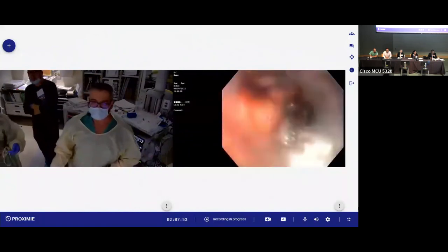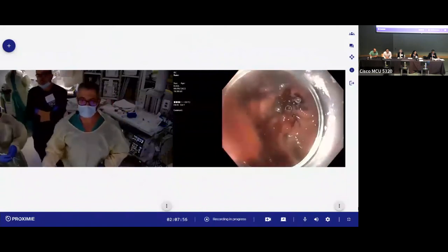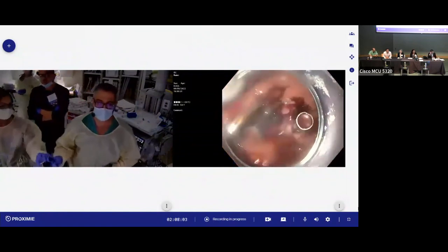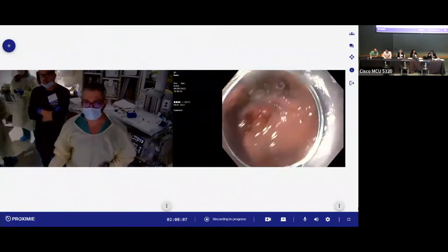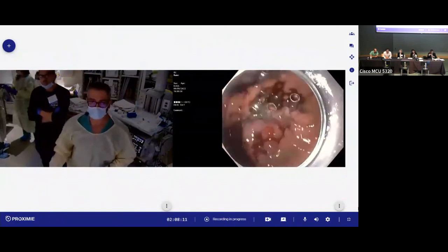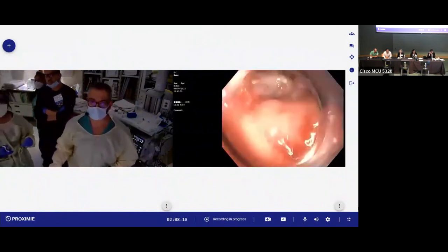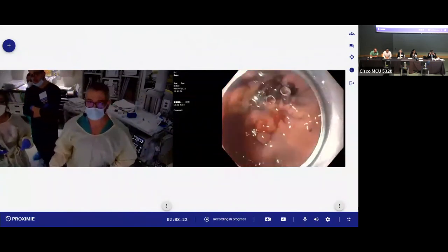Yes. So I would rather put more clips than have bleeding later on. But you can argue that's enough, Mohammed. But what do you think, Mahir and Sachin? So I think that it may not be as tightly closed as to seal a perforation, but there's some space there. So I would keep going till you think that it's technically getting difficult to do it, because the more you close the stomach, the better it is.